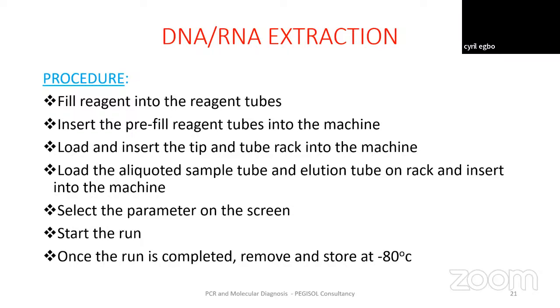Unlike some others, where there is one that extracts and there is one that analyzes, that one falls within this category too. But I just want us to know that there are some machines that you don't need to do any extraction. Just place your sample into these machines. They will do the extraction, the amplification, and the analysis for you. Then all you need to do is program the machine to do all this.